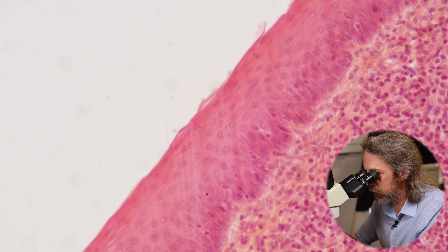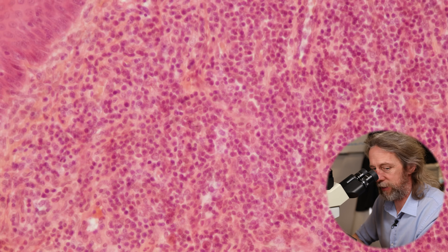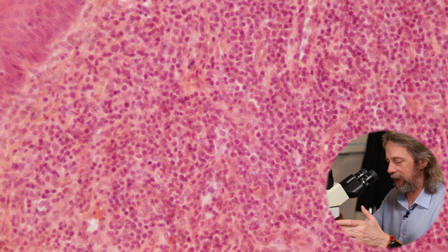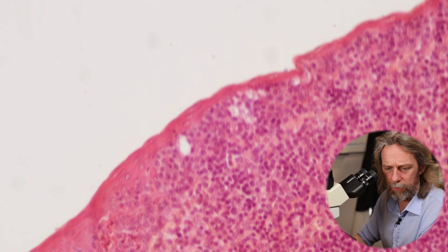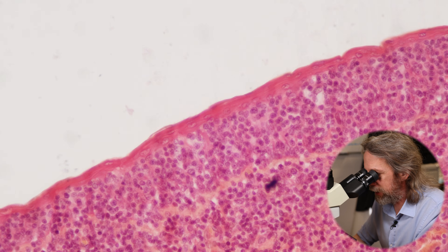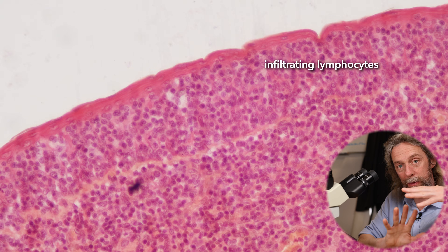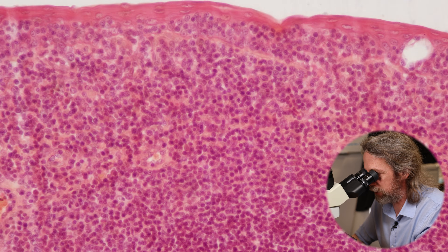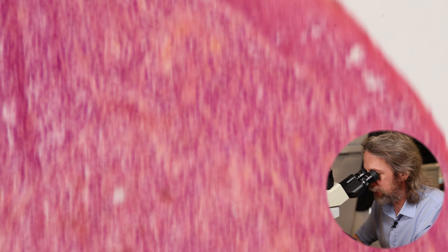You can see a nice multi-layered stratified squamous epithelium — as we get to the surface those cells get flatter. On this side we've got many cells, most of them dark-staining and round: that's the nucleus we're really seeing there, classic lymphocytes. As I slide around, the epithelium looks a lot thinner and we see those lymphocytes pushing in — this is classic for the tonsils. The lymphocytes infiltrate the epithelium because their job is to recognize threats in the oral cavity and pharynx.